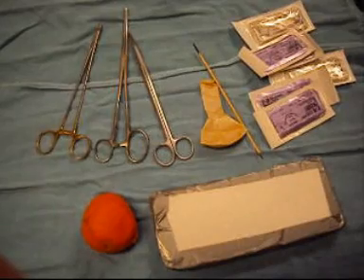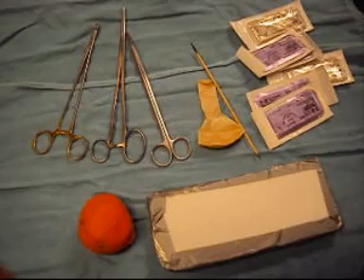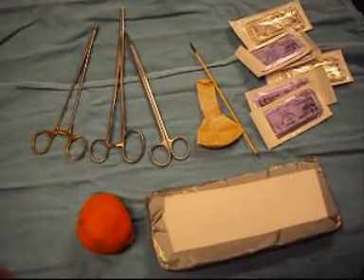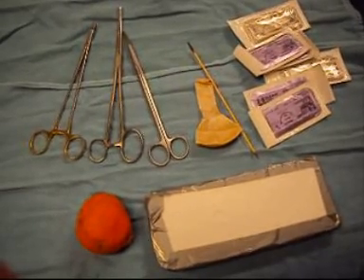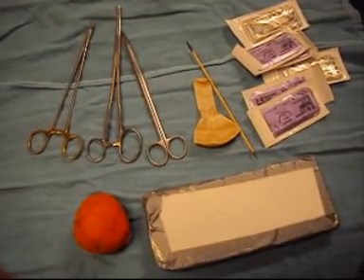For this experiment creating a prostate model for simple prostatectomy using fruit — in this case a clementine — you will need a clementine or similar citrus fruit, a piece of foam, and cardboard for fixation, as well as some basic surgical instruments.